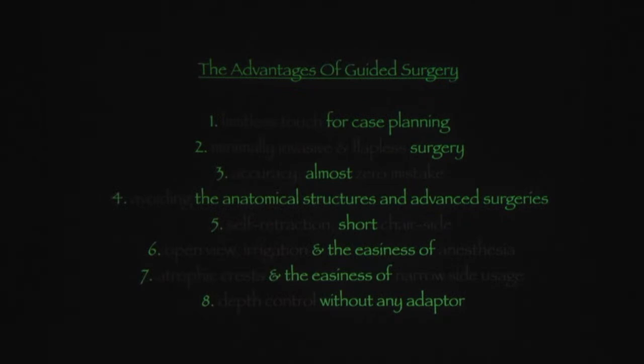The sixth one is open view irrigation, the easiness of anesthesia.